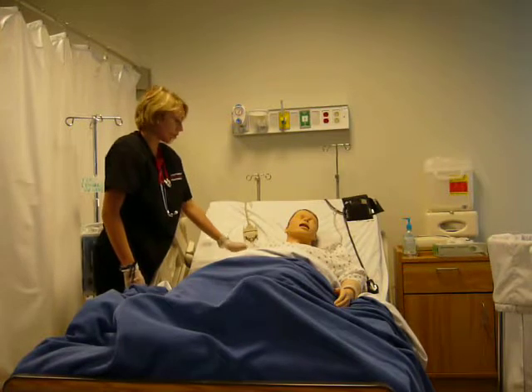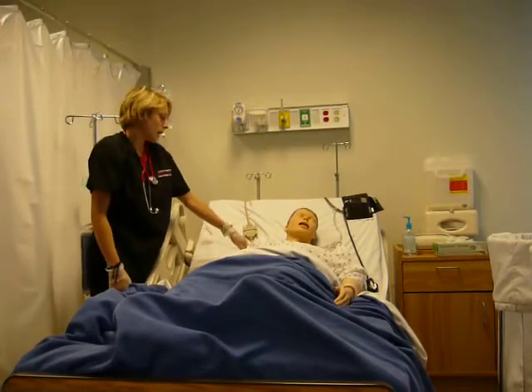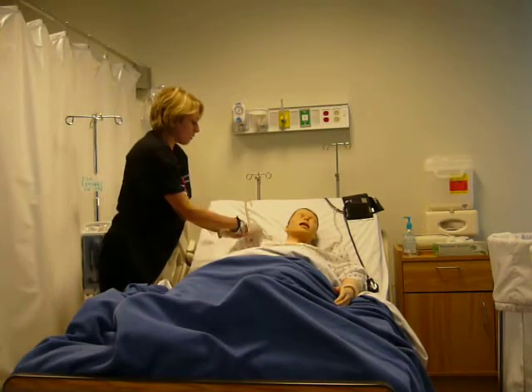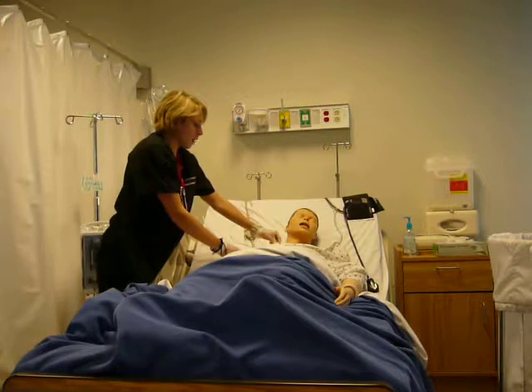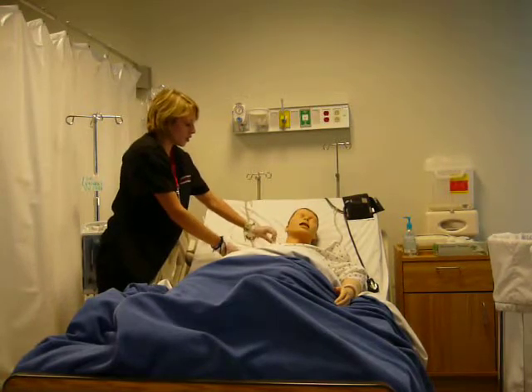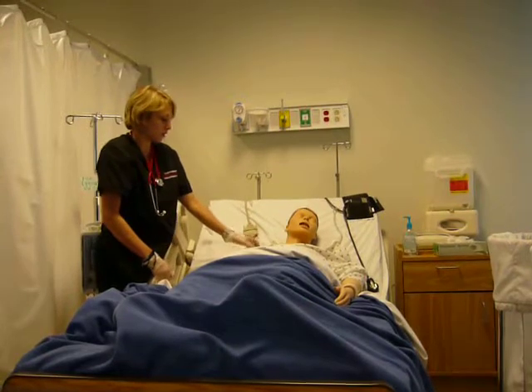Mrs. P has no redness or swelling or inflammation around her site. There's no drainage. The anesthesiologist taped it up here on the chest, and that's where we'll be giving it. We want to make sure there will be a transparent dressing over it, so we can always see it at all times.